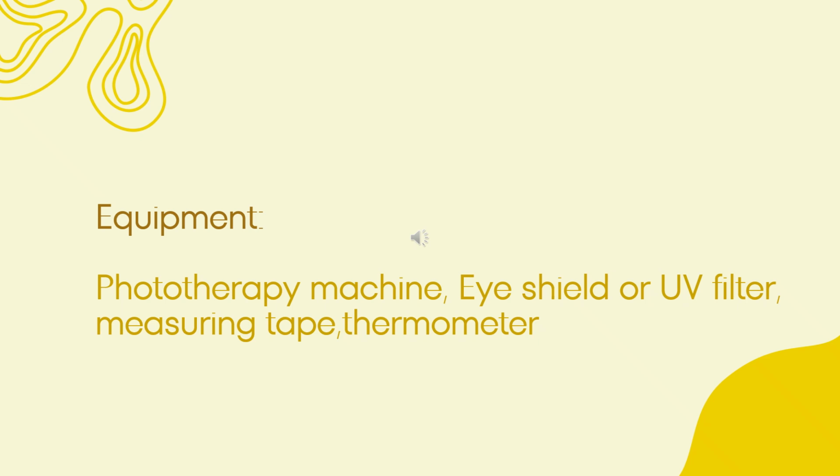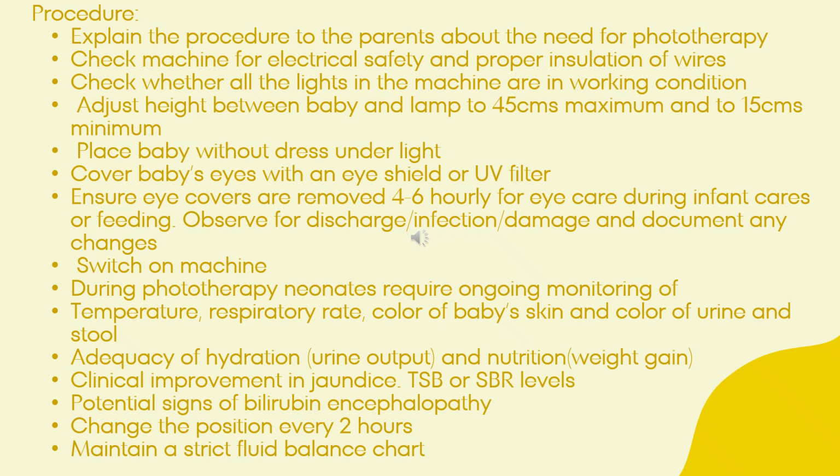Equipment needed to provide phototherapy: phototherapy machine, eye shield or UV filter goggles, measuring tape and thermometer. The steps to be followed during phototherapy procedure.